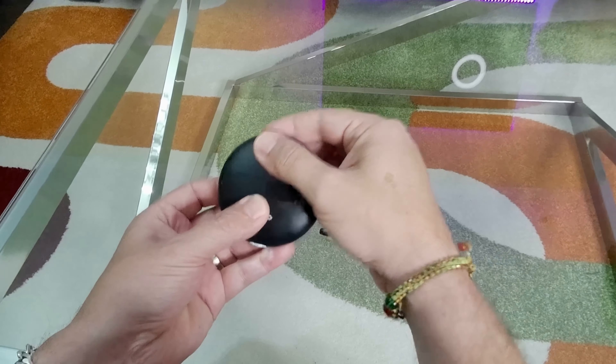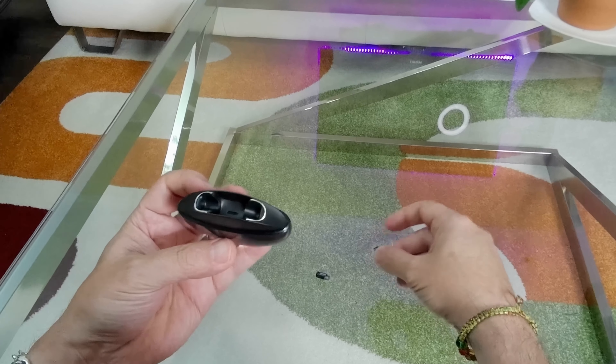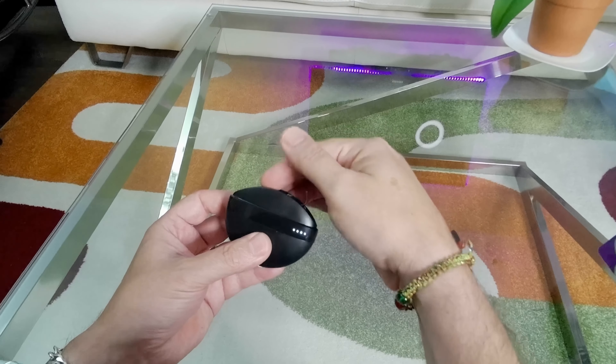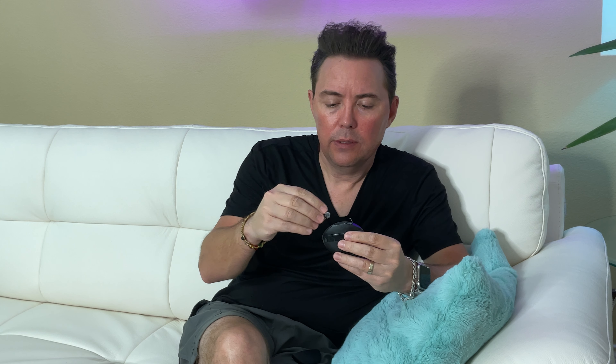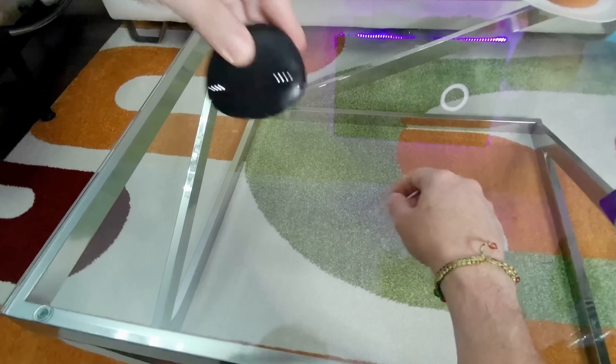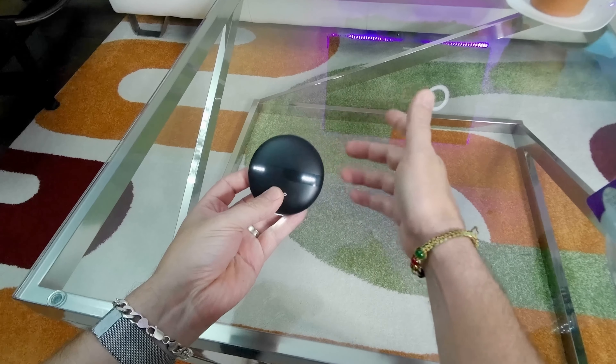They also redesigned the interior of the case. When you go to put the Ergos back in, you open it up and you'll notice that the lights light up so you can actually see what you're doing. Then as you put your Ergos into the appropriate slots, they're just magnetic — there are no longer the metal connectors to charge them that you kind of had to wiggle and play with. These just drop right in, like a pair of AirPods would. Because they're magnetic, they're going to stay in the case even if you turn it upside down and shake it, so that's a huge benefit as well.